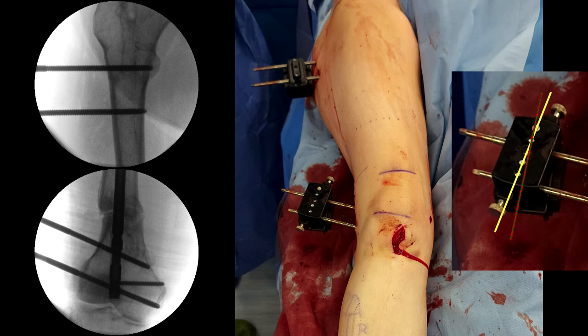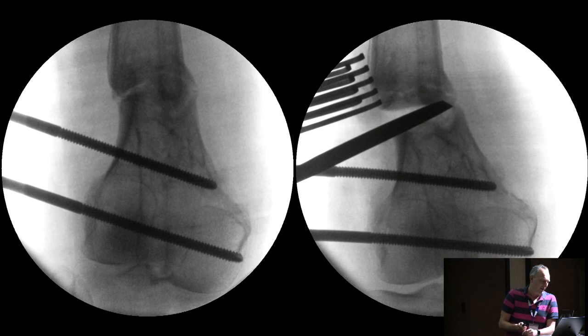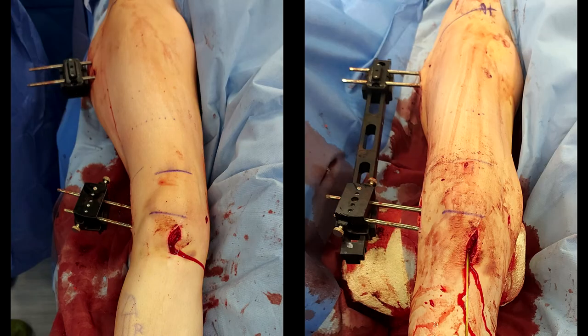I do this simply because I find it easier to put a pin in parallel to the joint than at 10 degrees. It saves me having to put a marker wire in. You could do it either way. Performed our corticotomy. It had united medially, partially united. And there you can see our correction.